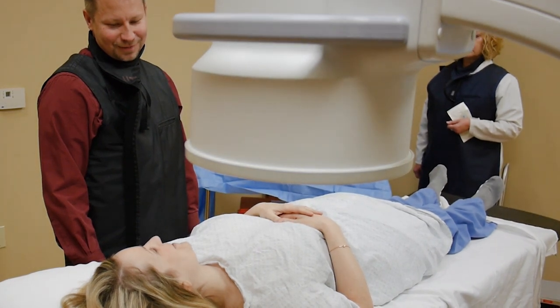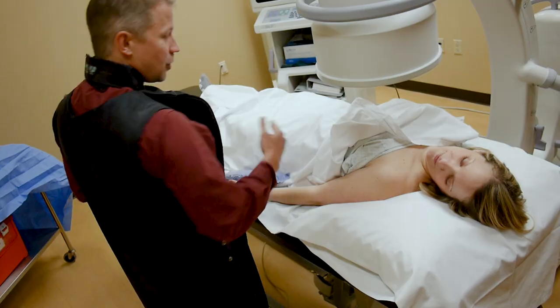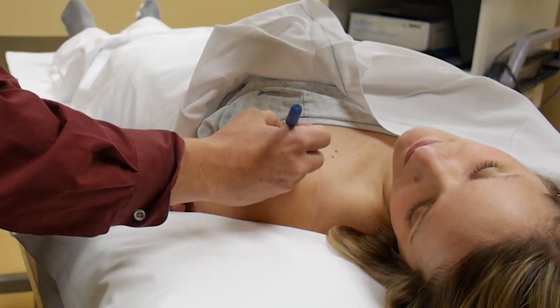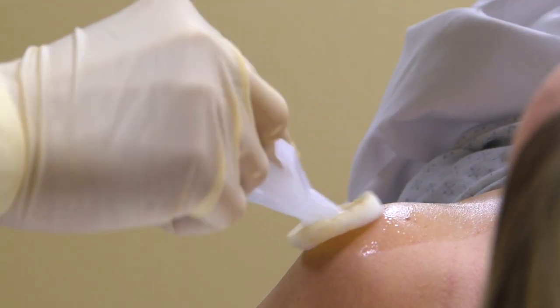When you arrive for an arthrogram, the first thing I do is meet you in the waiting room and go over the consent form with you. I'll tell you what we're doing, why we're doing it, and then we take the patient to our fluoroscopy room, which uses portable x-ray. We focus just on the joint of interest. I will mark the skin with a magic marker — that's the side I'm going to be working — and clean the skin off with some betadine soap.